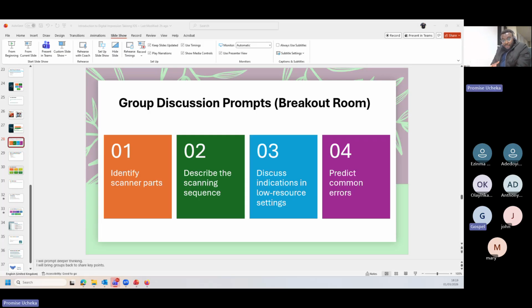Yes, go on. I want to add some light, to discuss my own experience with moving a cast that resulted in a mess. We had a patient who needed a zirconia crown, and we took an impression and sent it to the lab.